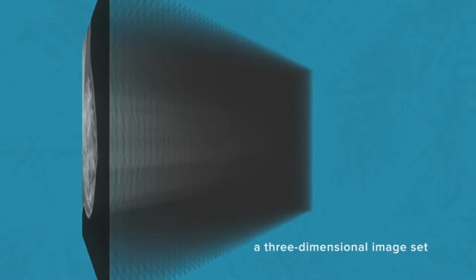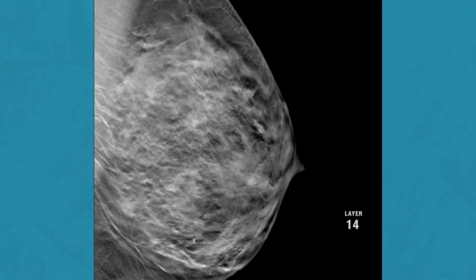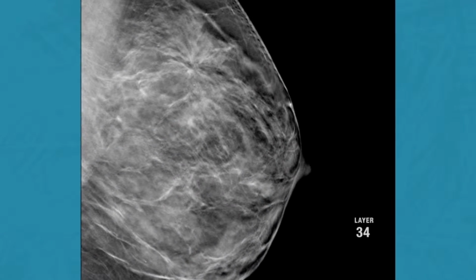Conventionally speaking, a 2D mammogram is done in like a flat sheet of paper, so you have this phenomenon called superimposition. Because you're looking at a flat image, the anatomy superimposes upon itself and can create the impression of a mass, or worse yet, obscure the presence of a mass. With a 3D mammogram or a tomosynthesis, we can scan progressively through the breast and rid ourselves of that phenomenon, the superimposition phenomenon, and see things in greater detail and see them essentially in 3 dimensions.